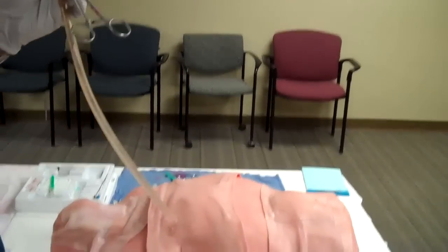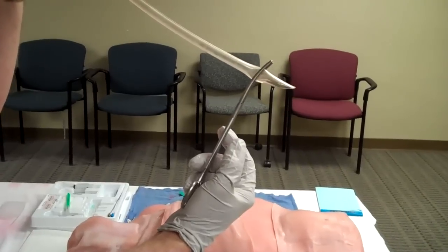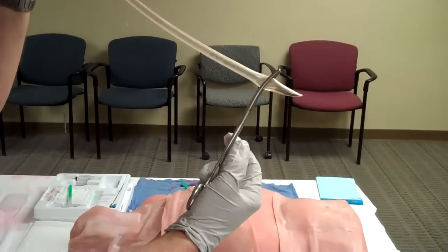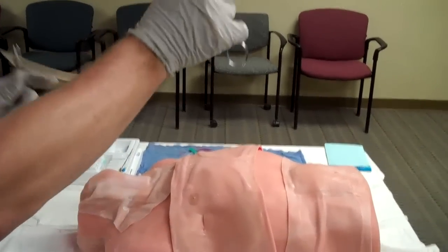And then another important thing is to put a clamp on the other end of the tube. Because if, as we fear, they have some blood in their chest, it may come spewing out of the chest tube, hitting everybody else in the room. So now, I'm actually going to insert it into the chest.